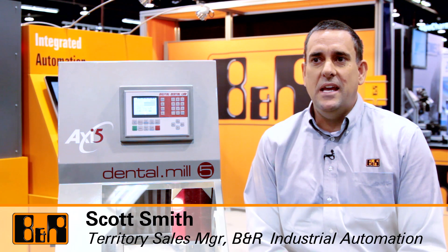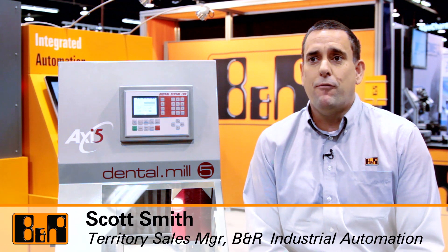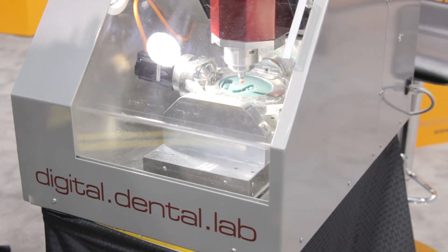My name is Scott Smith and I work with B&R Industrial Automation in Southern California Territory. We're here today to talk about our customer's machine, the Dental Mill from Digital Dental Labs.